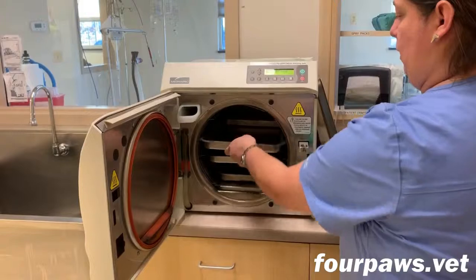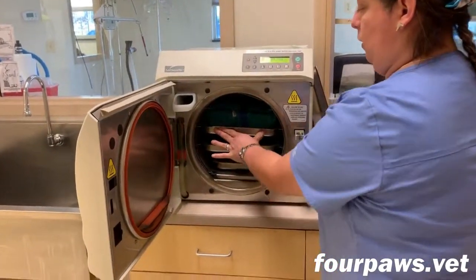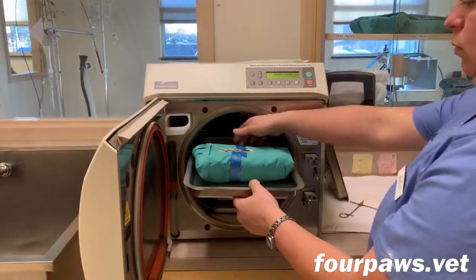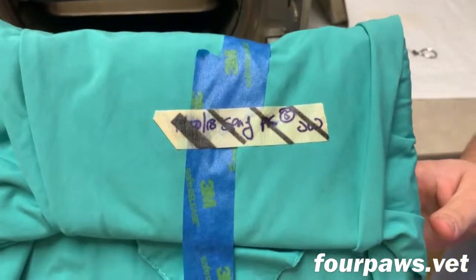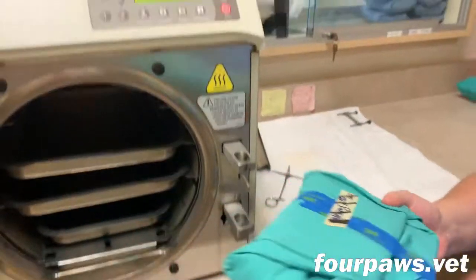Once the packs have been prepared, they're loaded into the autoclave for the sterilization process. Once the autoclave is finished, the packs are removed and you can now see that the indicator tape on the outside has some black stripes on it. This lets us know that the sterilization cycle was completed properly.